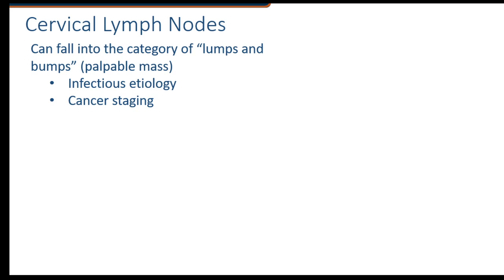They had some increased size of the lymph node, and they're aware of it, and they look at it. It's not always the case. Sometimes you can feel small little lumps and bumps, and they're just normal lymph nodes. And we'll look on those at ultrasound, and I'll show you what normal ones look like, and I'll show you what reactive ones look like.